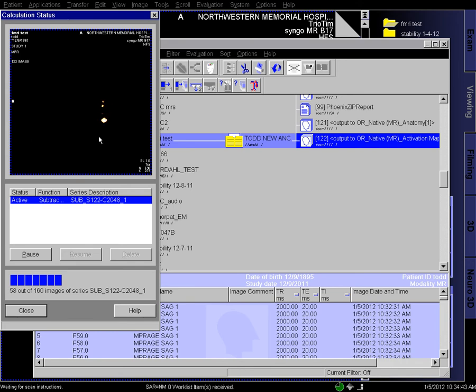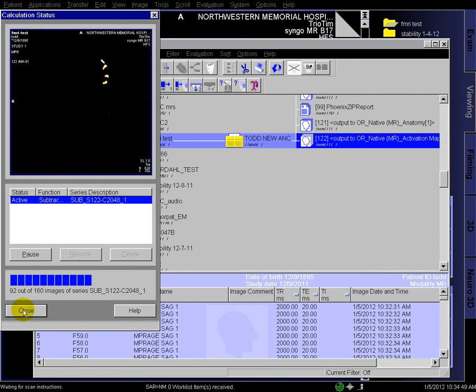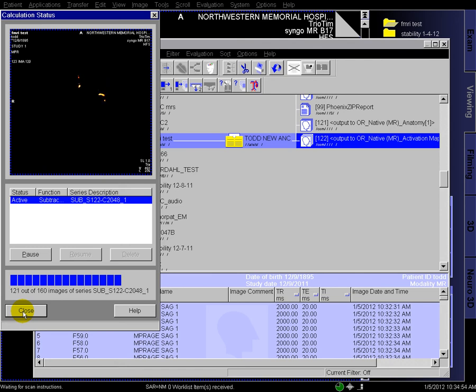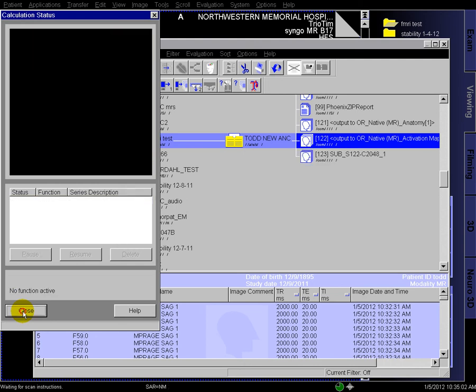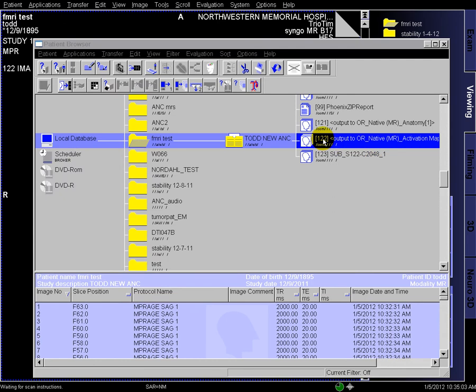So most neuronavs are swamped by such a large number, so by removing this, we'll make the activations in the 200 range or so, 200 to 300 range, and we can then overlay that on the anatomy scan and keep the DICOM data so that the computer in the OR can use that.